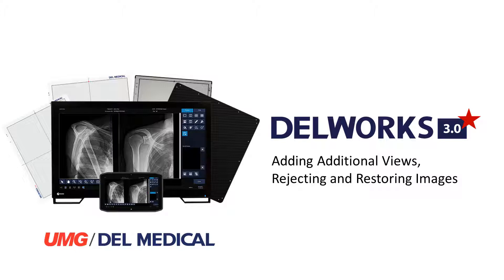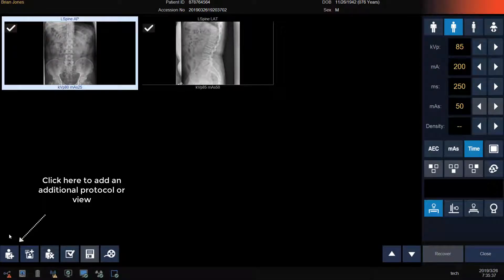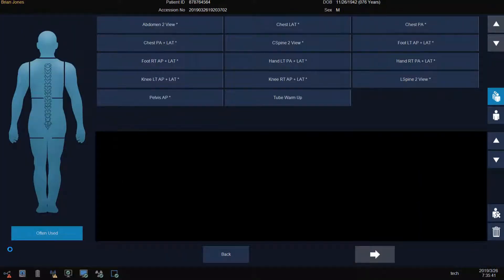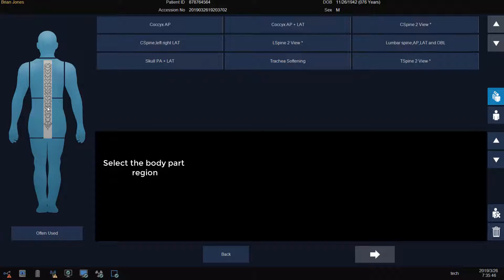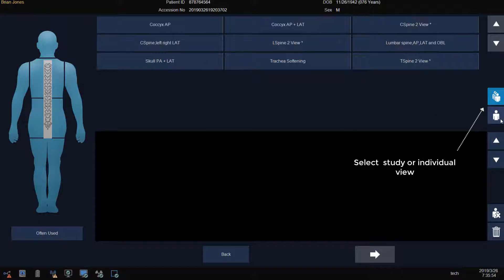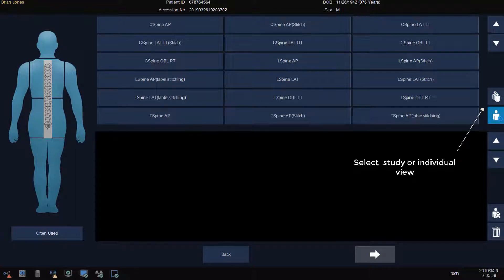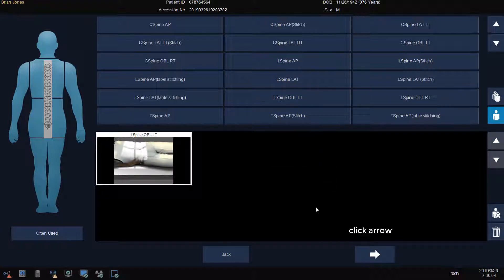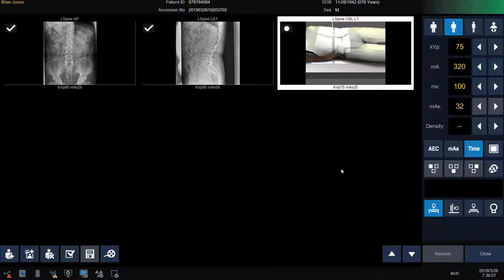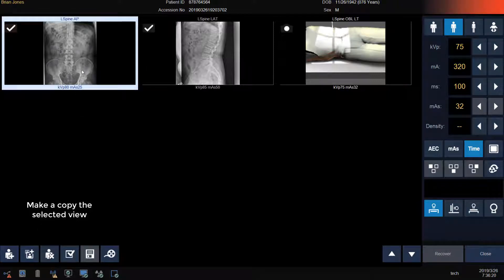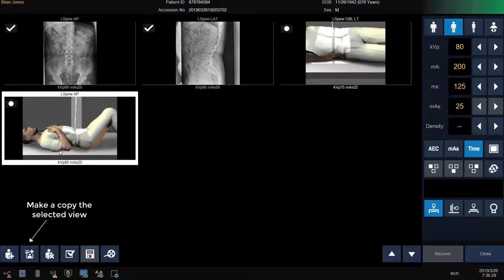In the next section of this video, we will review adding additional views, rejecting, or restoring rejected images. Click on the icon with the man and the plus to add an additional view. Select your region, select the protocol that you want to add, or click on the single man icon to see a list of the individual views in that body region and then select the view. Now click on the arrow. We've now added a lumbar spine oblique view and are ready to expose. If I want to make a copy of a view that I've already performed, I can click on the image and then click on the two image icon with the plus. Now I've created an additional AP lumbar spine view.